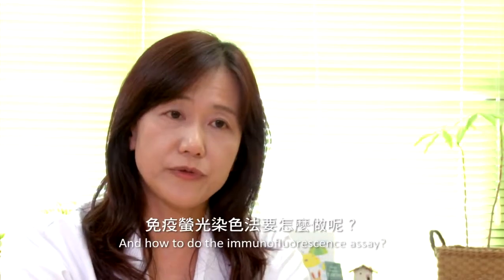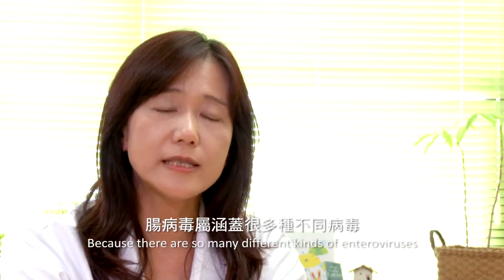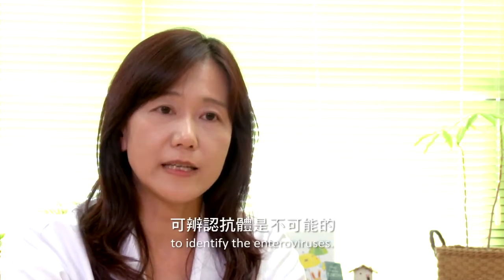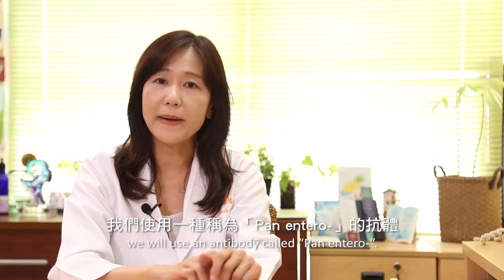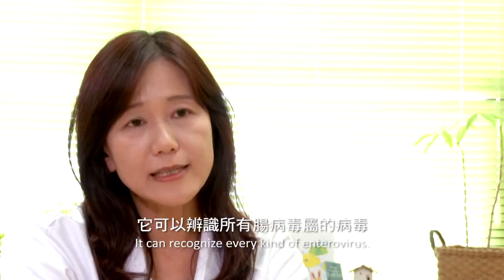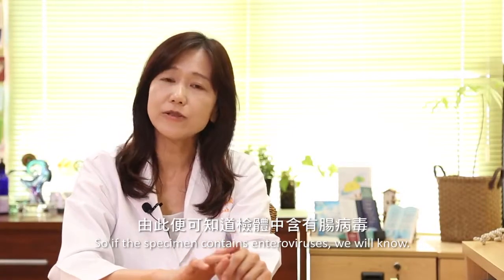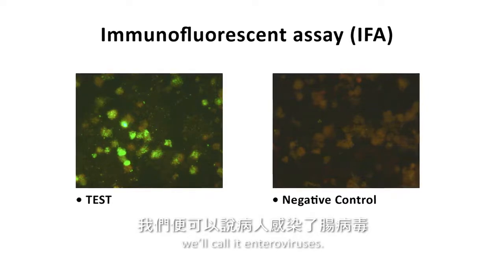And how do we do the immunofluorescence assay? Because there are so many different kinds of enteroviruses, it's impossible to use every antibody to identify them. So in the beginning, we will use an antibody called pan-entero antibody. This antibody is quite special. It can recognize every kind of enterovirus. So if the specimen contains enteroviruses, we will know if it's a positive signal, we call it enterovirus.